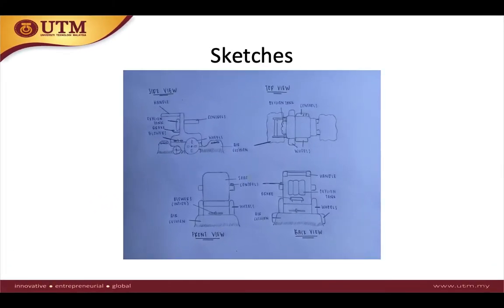These are my hand sketches of the Harvard wheelchair, which can be seen from the side view, the top view, the front view, and also the back view of the wheelchair.